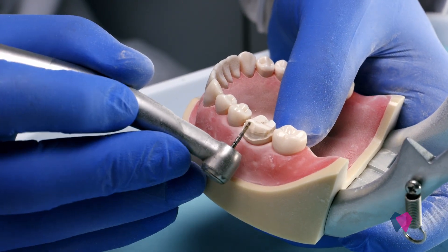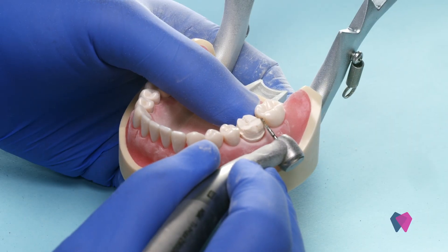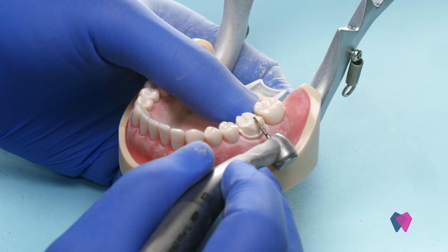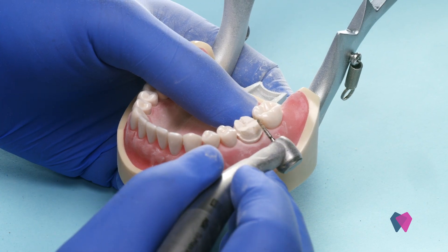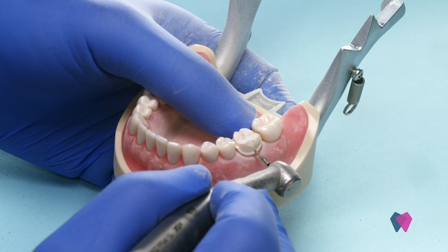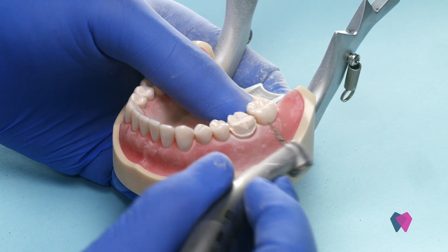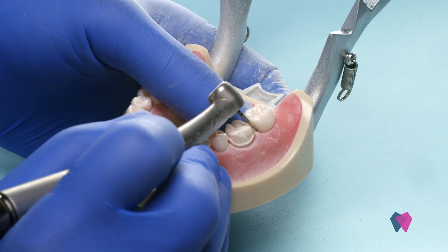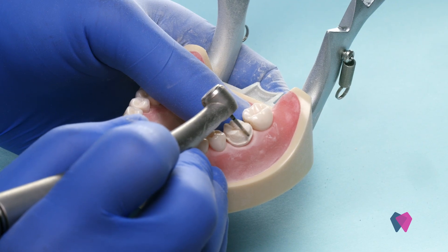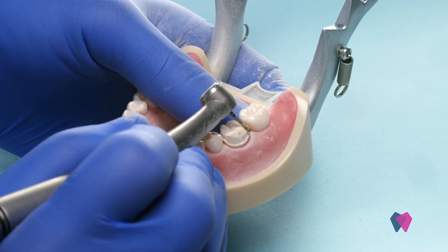Using this same diamond, you've also got to make sure that you place your second tier, or your beveled aspect, to the cusp tip. Because remember, this tooth comes straight up and then it bevels in towards the lingual, so you've got to take your burr and make sure that you remove about 1.5 millimeters on that surface as well.